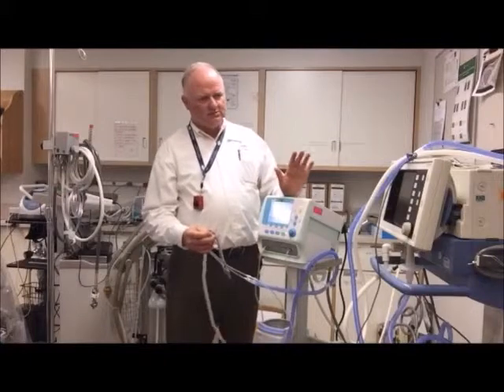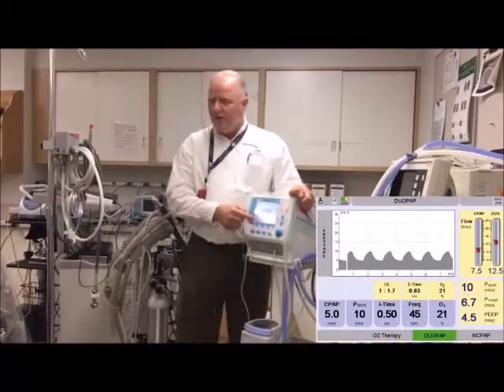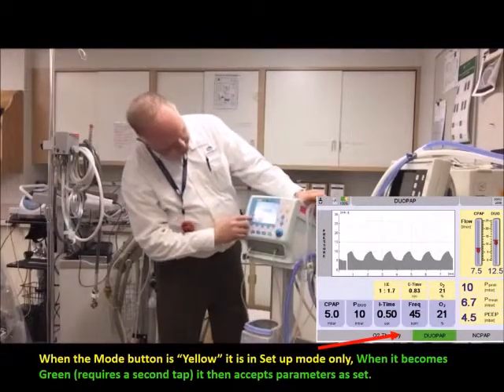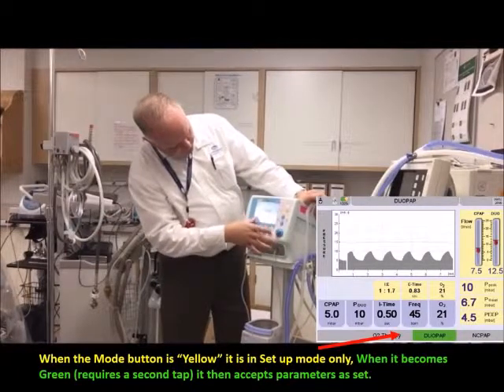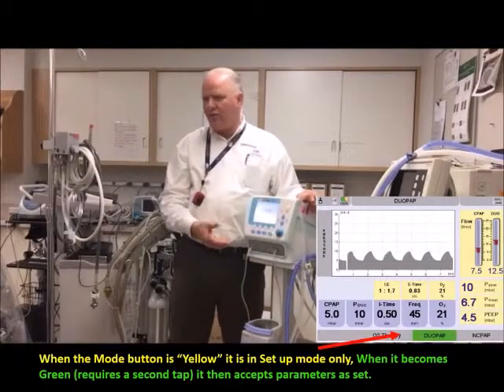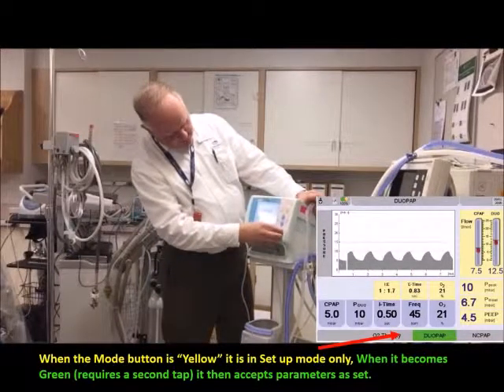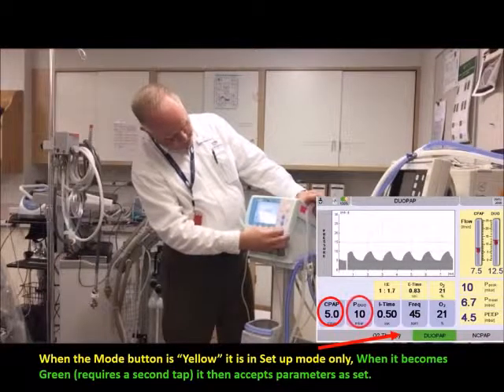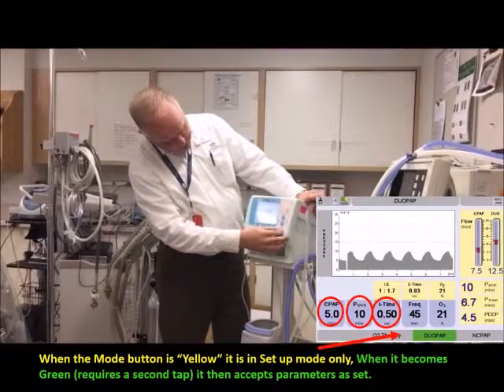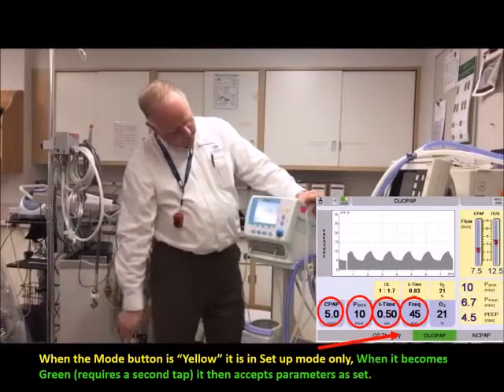If it's been more than five seconds and it can't compensate back into range, then we want the alarm to go off so you come over and check that nothing's wrong. We can go back to the dual path screen — we're still in nasal CPAP since nasal CPAP is green and the dual path is yellow. On the dual path settings: PEEP of four, high pressure of eight, inspiratory time of 0.4, and a respiratory rate high limit of 60. Hit dual path and away we go.